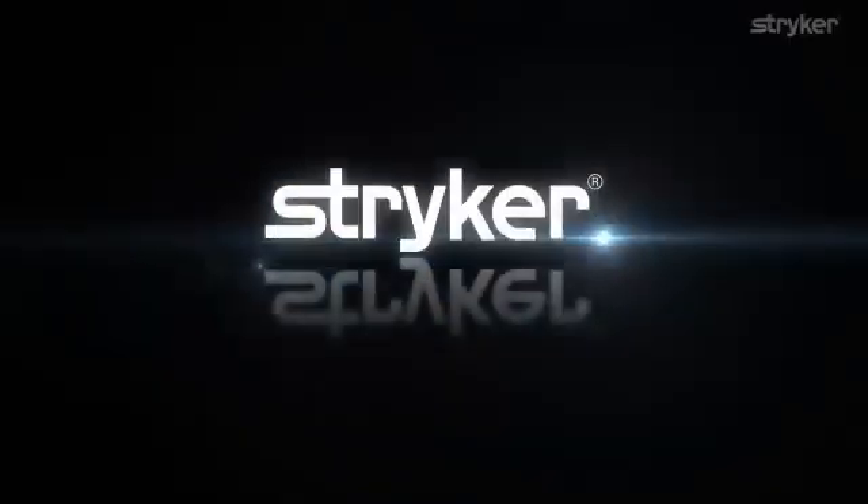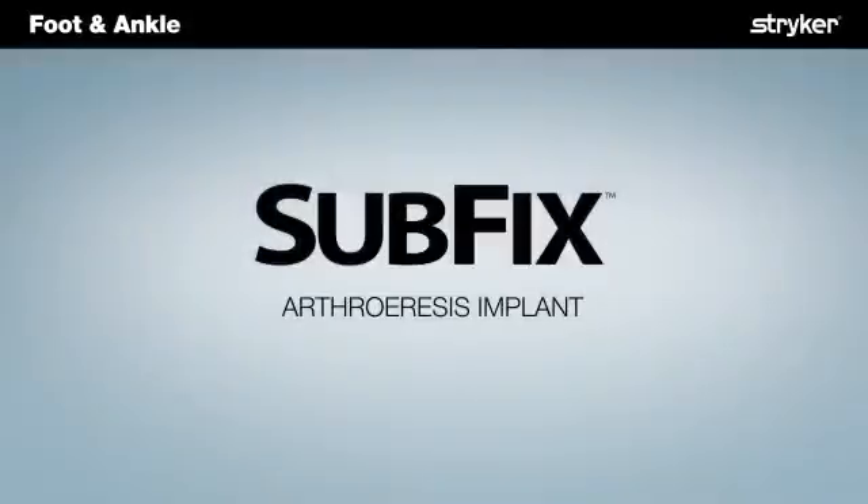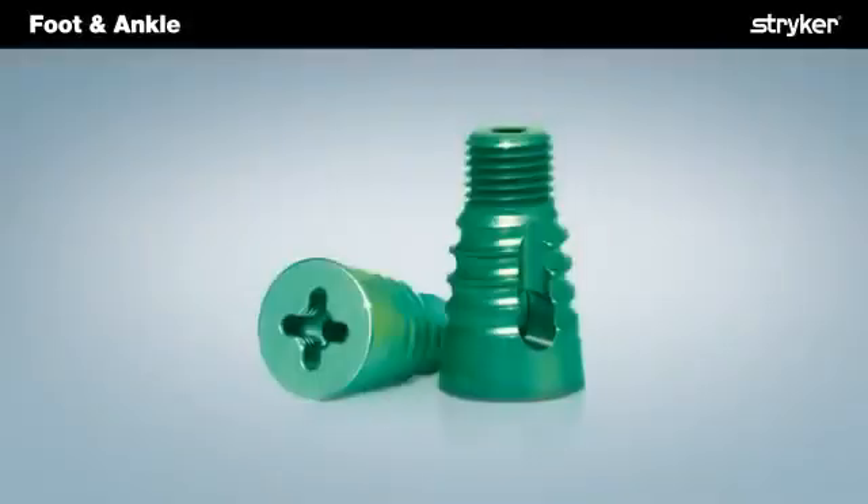The SubFix arthroereisis implant from Stryker Foot and Ankle is intended to treat the hyperpronated foot and stabilize the subtalar joint. It is intended to block forward, downward, and medial displacement of the talus, thus blocking excessive pronation and the resulting sequela.